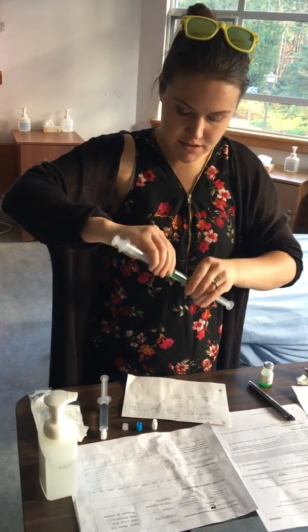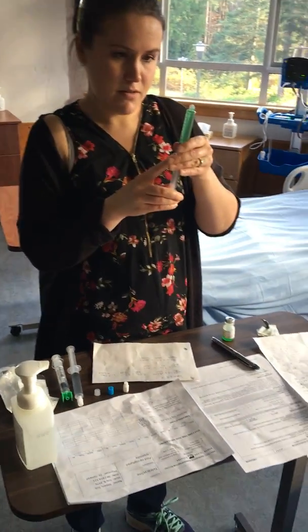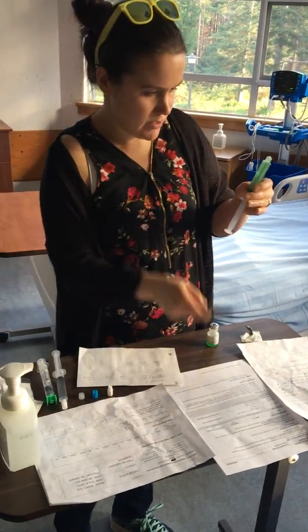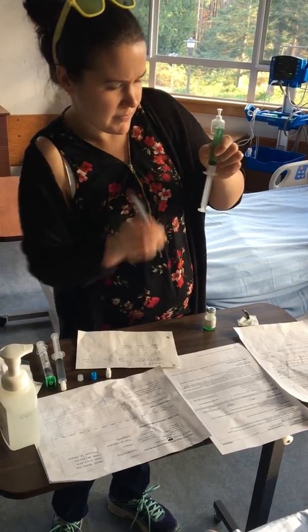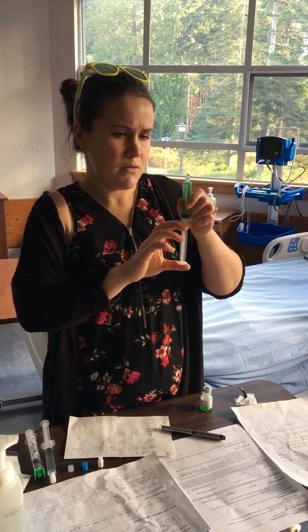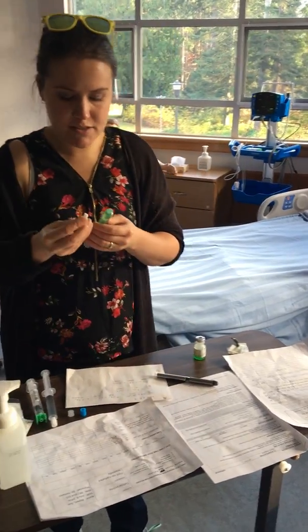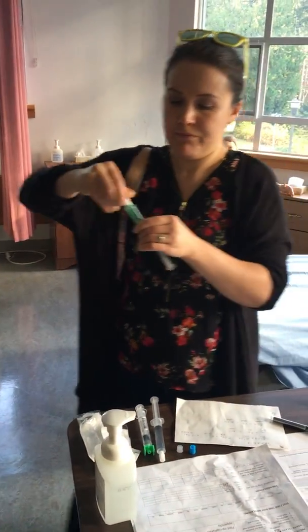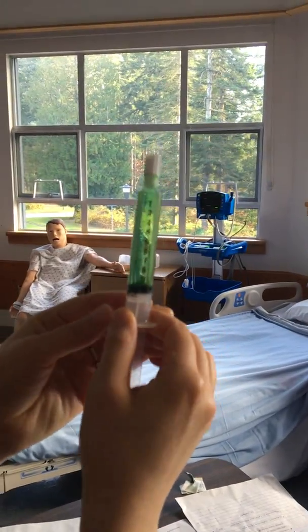Okay, now I can take this connector off. I'm going to make sure there's no air in here. There's a little air bubble at the bottom. Okay, there we go. Now I can push the air out. And now I need to waste. So I've got 10 milliliters in here, so you know it's the right concentration.